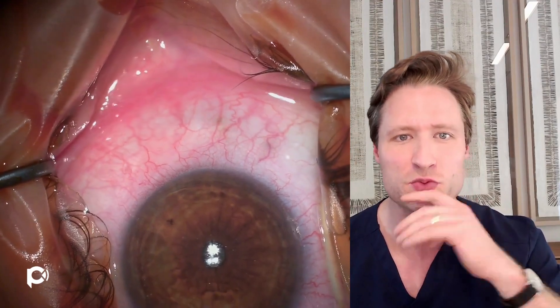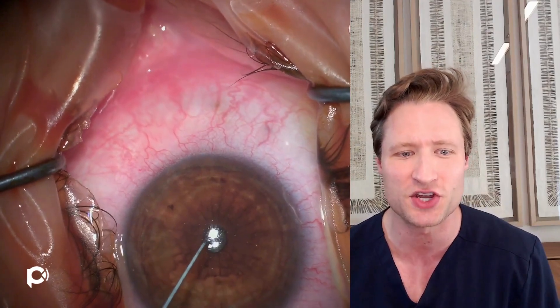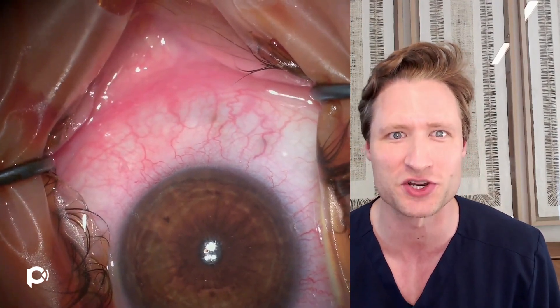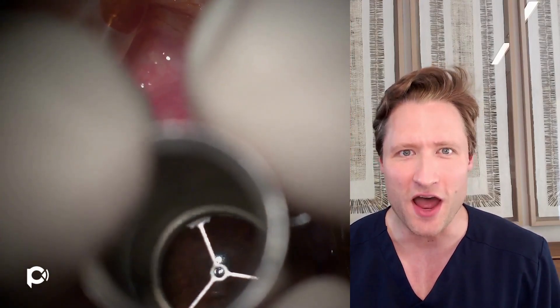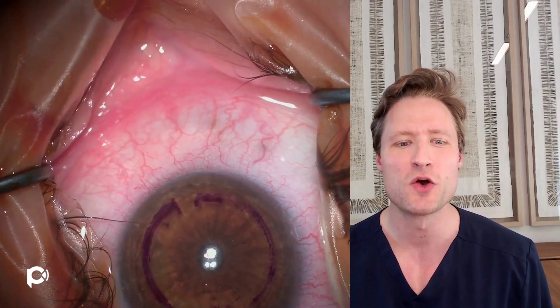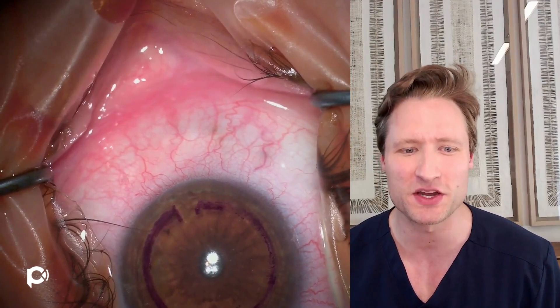You'll notice we've just made the epithelial impression with that zone marker over the first Purkinje image. Now I am dotting the center of that impression using a gentian violet inked Sinski hook, and that lines me up. I'll then make another epithelial impression using a gentian violet inked glide marker, which shows me where the channels will be dissected in the recipient cornea.